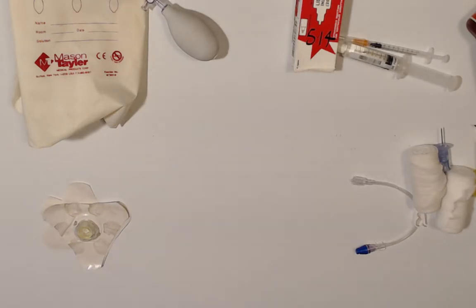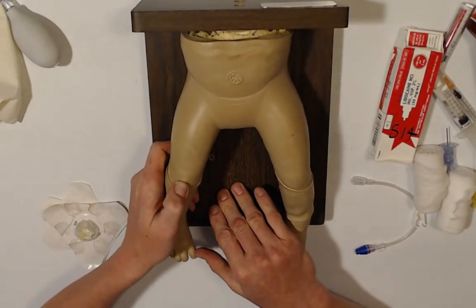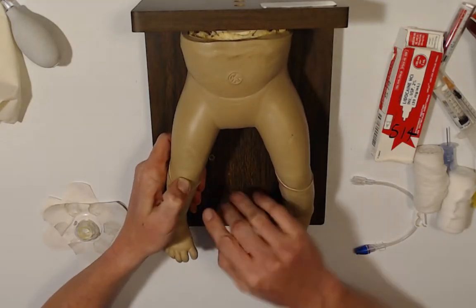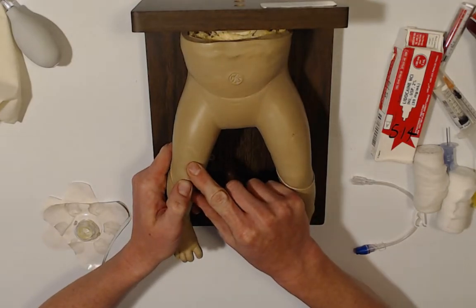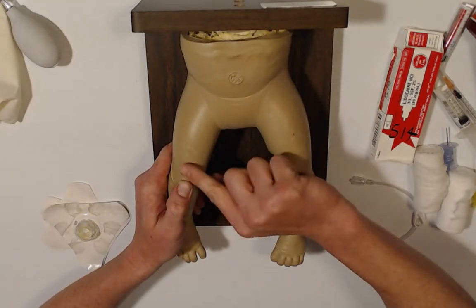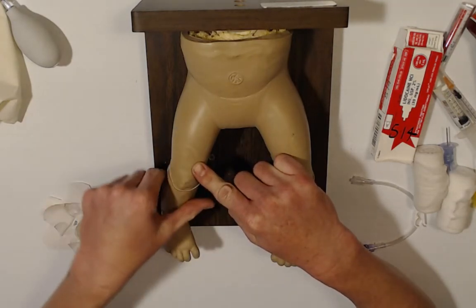Now, if we're going to do the femur on a kid, what they recommend is you want to palpate for that patella. At the very top margin of that patella, we're going to go 1 centimeter proximal, which is probably about a finger length. And then they say to go about 1 centimeter medial. So again, it's not right on top of the ridge. We're going to go 1 finger up, 1 finger in on the medial. This is actually really low, really distal on that femur.